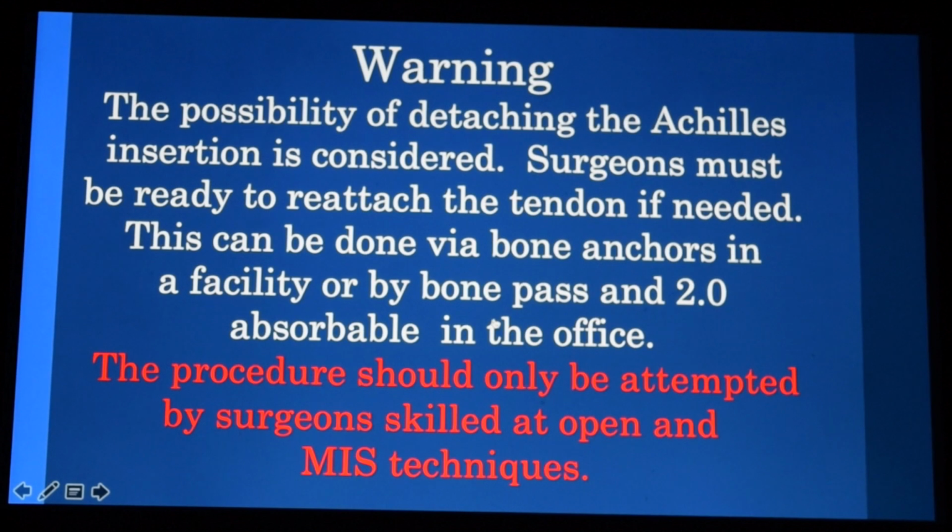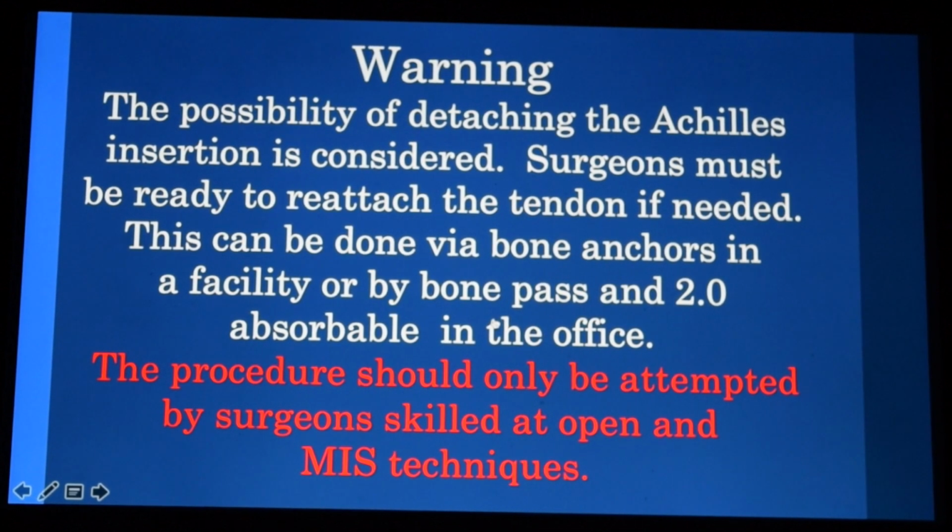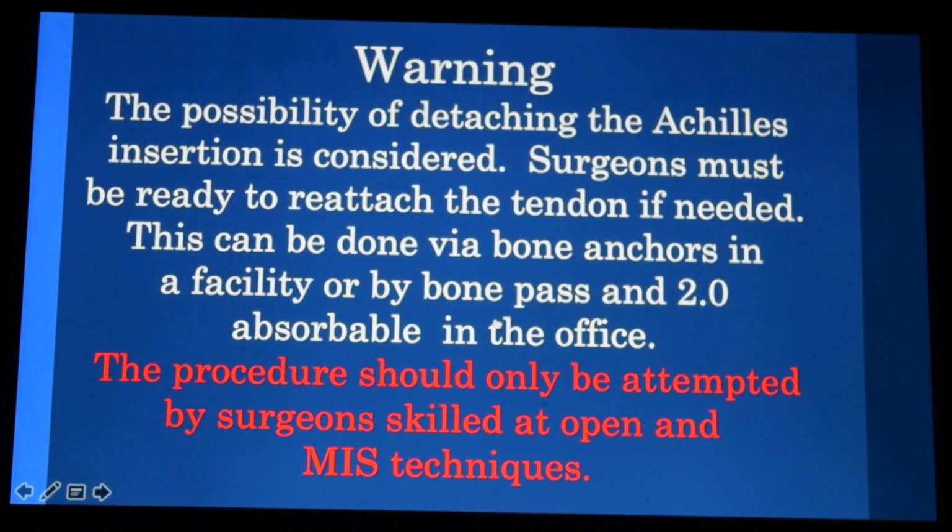So you can get your feel down for this. You got to make sure you're staying on the bone, not hitting any soft tissue. So this was a more advanced procedure, and it should be done only by people very skilled at MIS surgery and very skilled at open surgery as well.